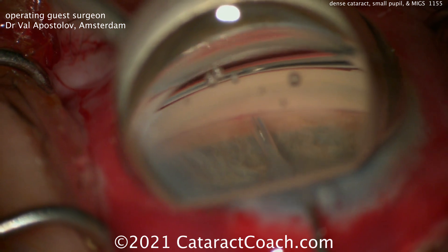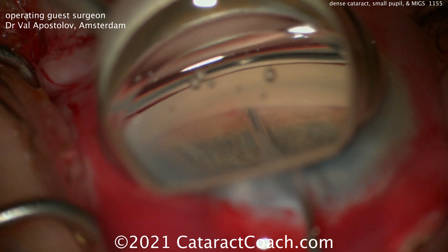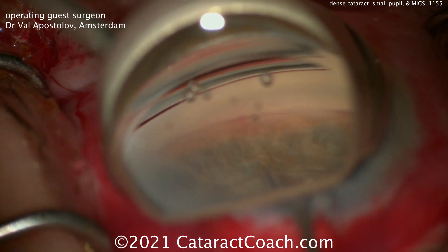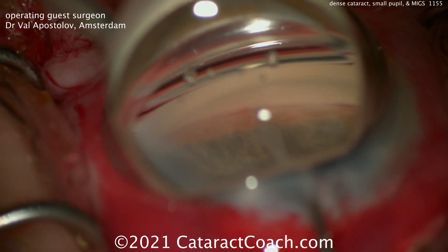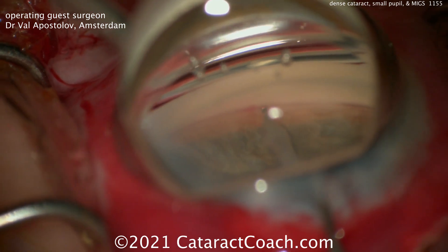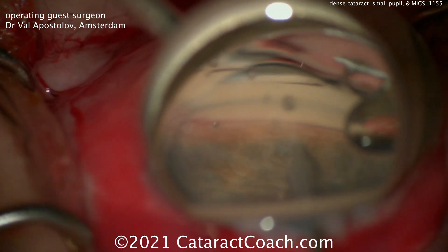Now let's see the MIGS. This looks like an iStent inject, going here to place these devices very appropriately. Nice view with that gonio mirror. There's one device and here comes a second. Beautiful result for this patient. Thank you, Val, for sharing your videos. In a patient like this, MIGS is a good choice, especially for an 87-year-old with glaucoma that wasn't too out of control. Remember to go to CataractCoach.com and sign up for a free daily email — we'll send you a great video like this and other surgical pearls that'll make you a better surgeon.